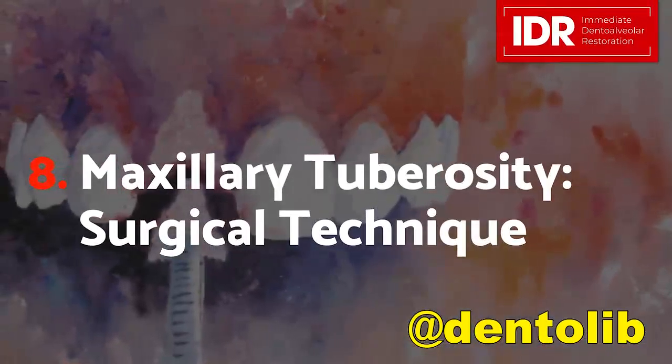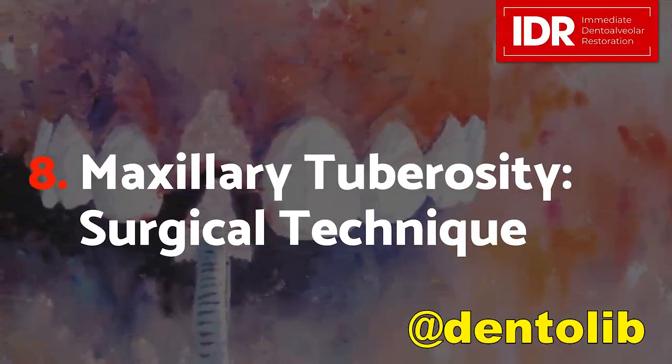Module 8, Maxillary Tuberosity, the surgical technique. In this module, I'm going to present for you several different approaches of graft harvesting from the maxillary tuberosity. This is one of the most important modules of this course. The main goal here is to learn how to take bone from the maxillary tuberosity in the easiest and the simplest way possible. Let's go.